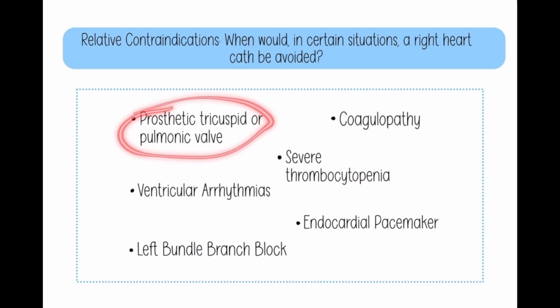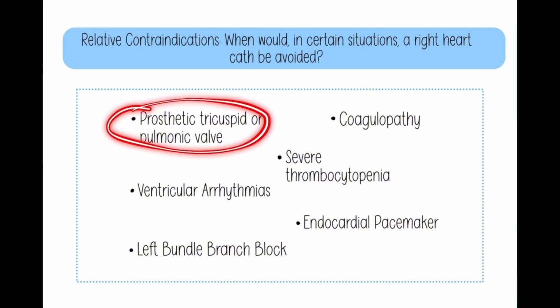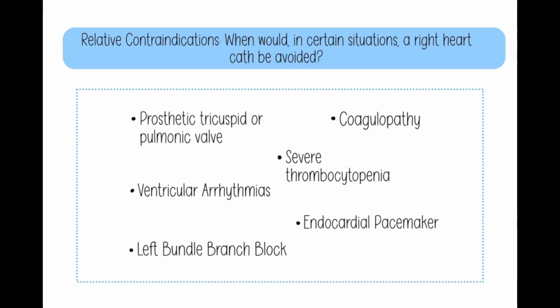They could have a surgical valve that is failing, but if it's functioning and there's nothing wrong with it, right, you don't have that indication from an echo that there's something wrong, it's not worth crossing through with our catheters and messing up the leaflets.